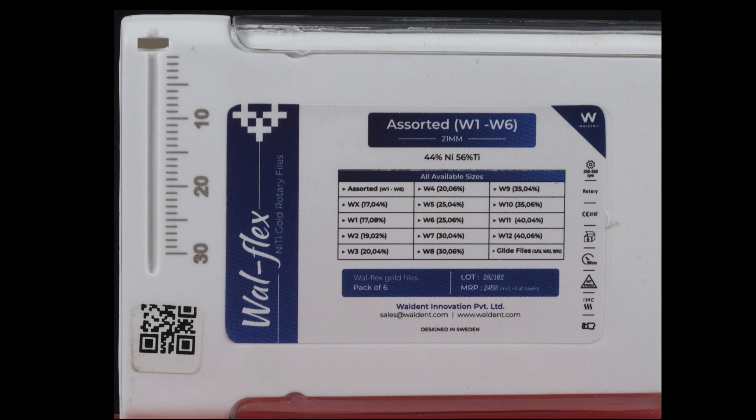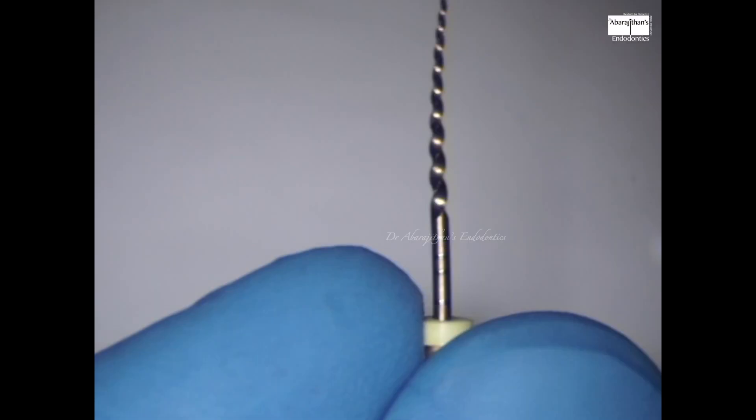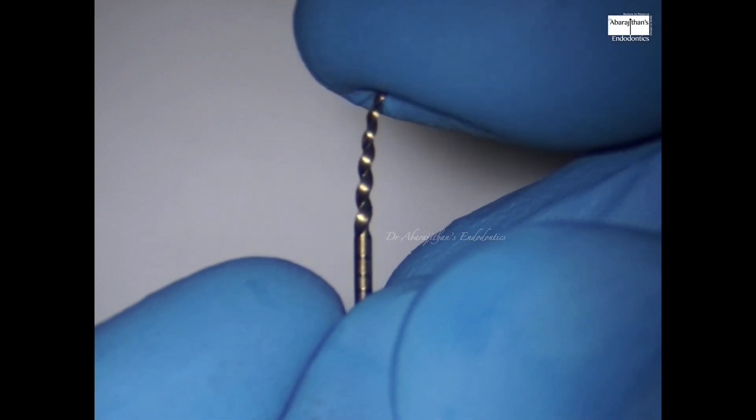Something that stood out in the packaging is that the box itself had an endo ruler, which can be used for measuring working length and also for measuring the master cone. I feel this will be really useful clinically.